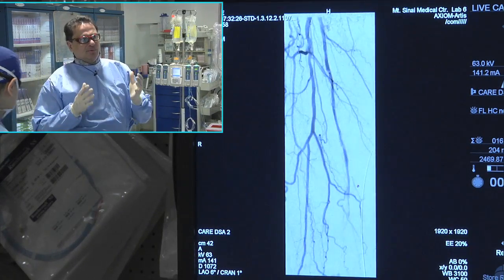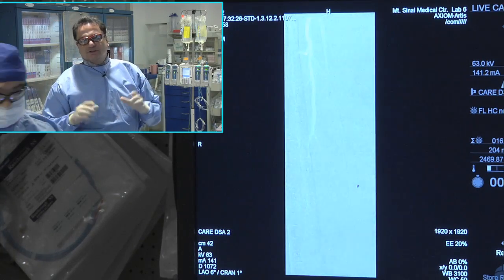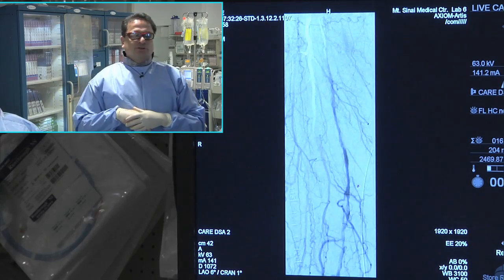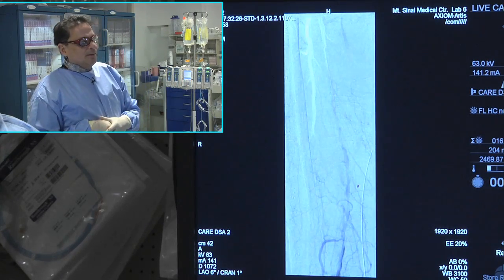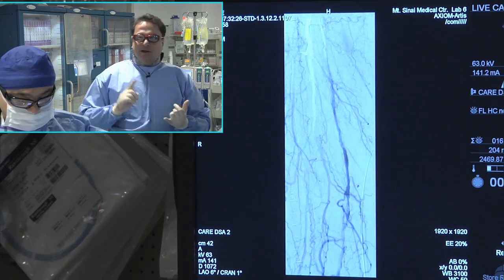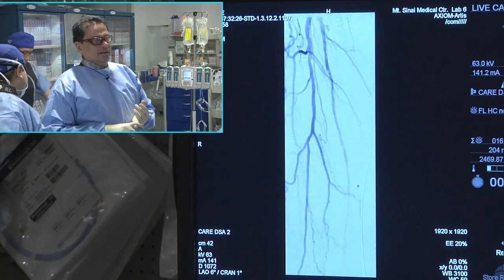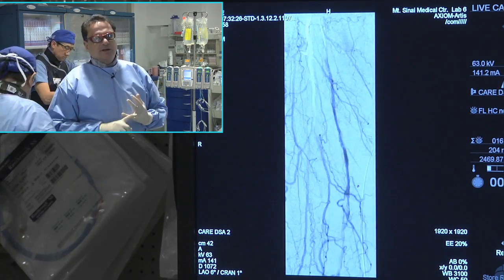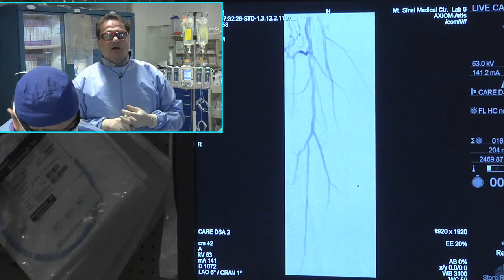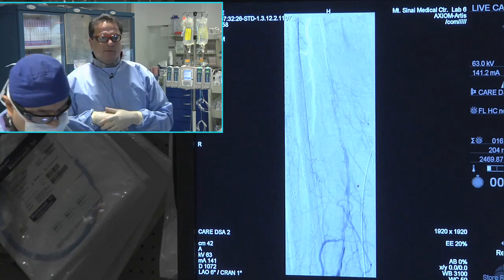But as clinical practitioners, we have to evaluate the data and apply it to our patients in the best way that we possibly can. There is going to be plenty of room for disagreement and personal preference, but I think we need to start talking. So let's take this particular patient. You have a patient with a long lesion, probably greater than 200, right? Right. In the entire involved cohort. Second, you have a degree of calcification. Third, what is it called? You have a runoff of, say, one vessel, if I remember properly.